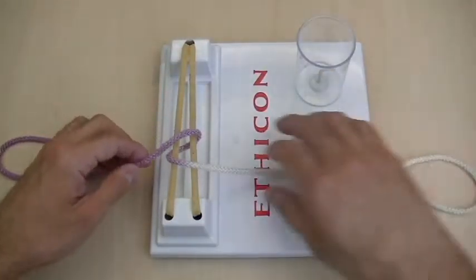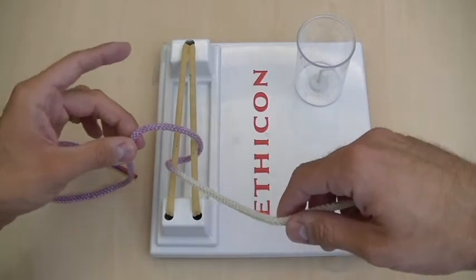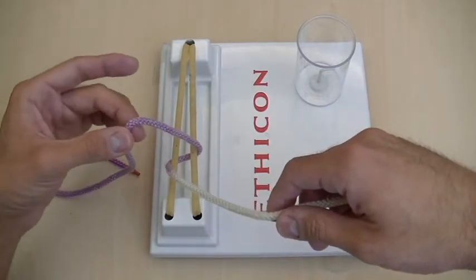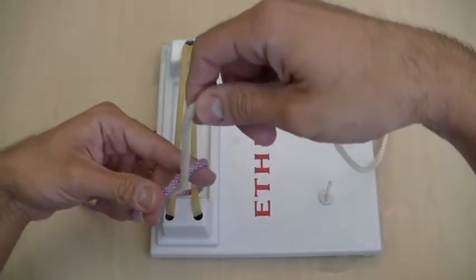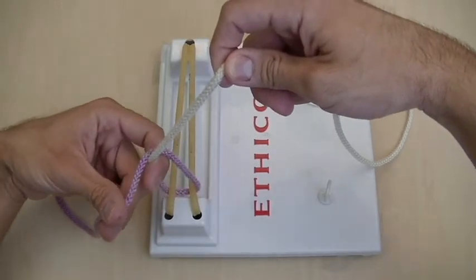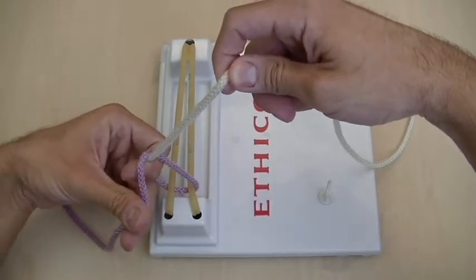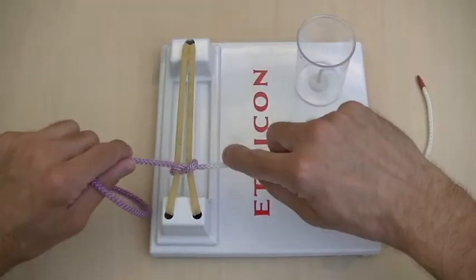So to go ahead and tie a knot with your left hand, you're going to pinch to do the overhand throw. With your thumb and middle finger, bring your index finger right here. Then what you're actually going to do is the index finger wraps around the white string, then under and over the purple string. And then you just pull it straight through like that, and lay down a nice knot.